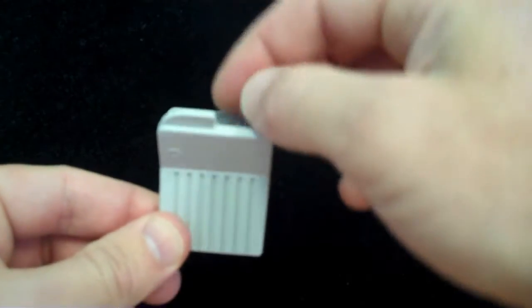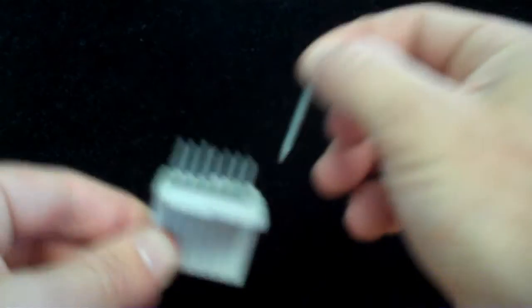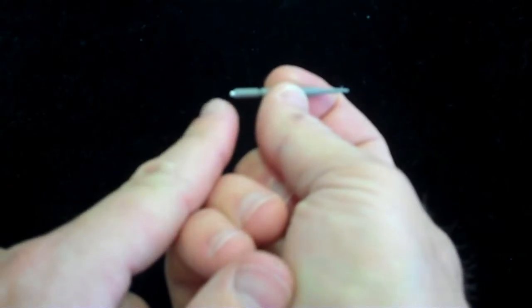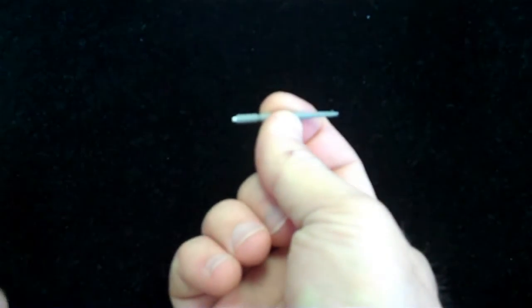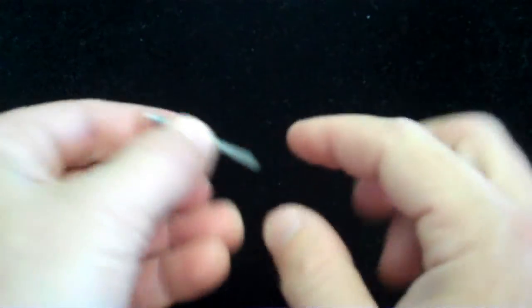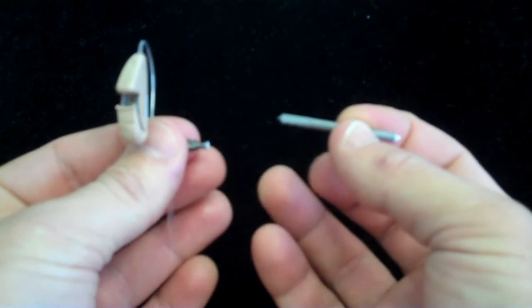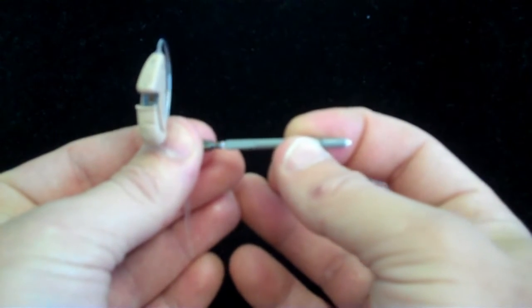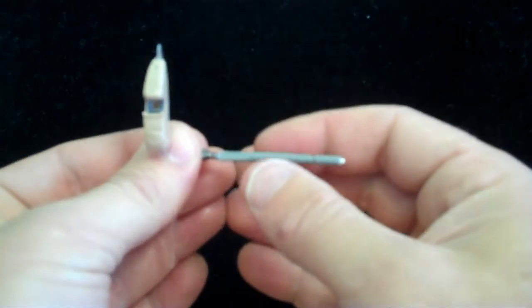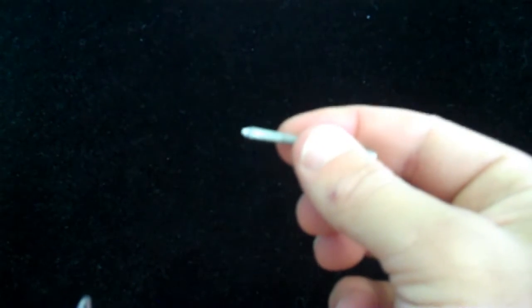You first open up the case, revealing lots of tools. We take one of those tools. You'll see on one side of the tool has a new white filter tip. The other side of the tool has a very little hook. The hook is used to remove the old filter. I'm going to take that little hook and push it right into the center of the wax trap. Ideally, when I pull, the wax trap comes out with the tool.